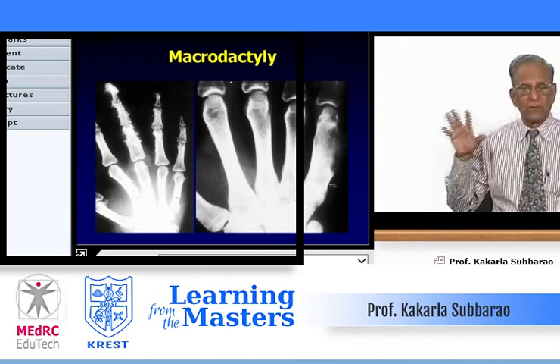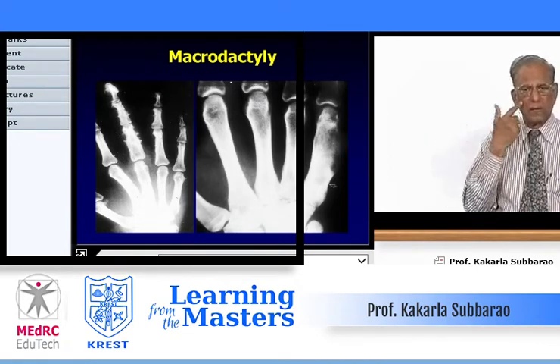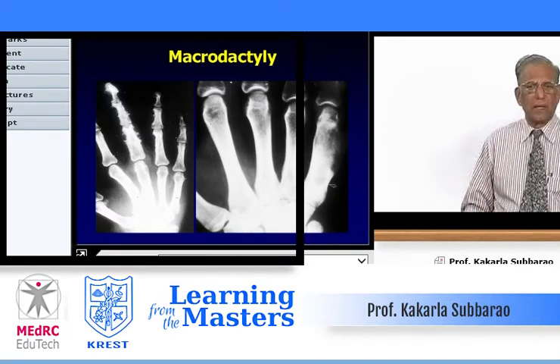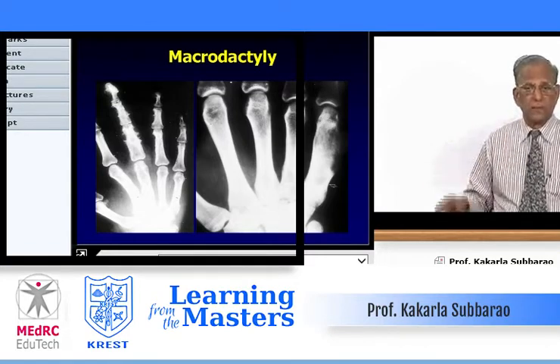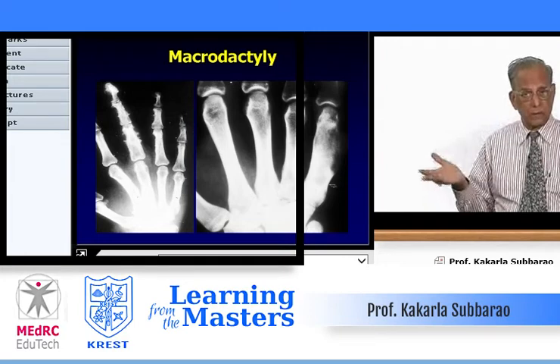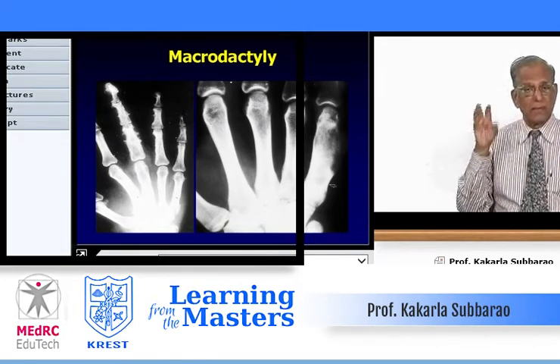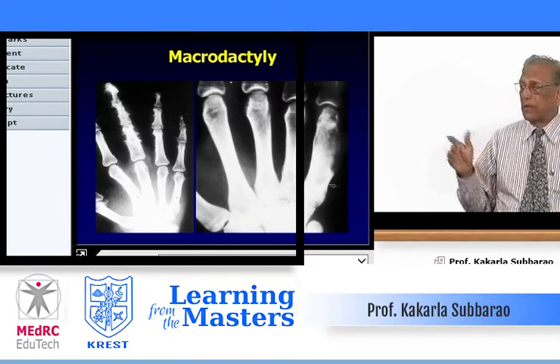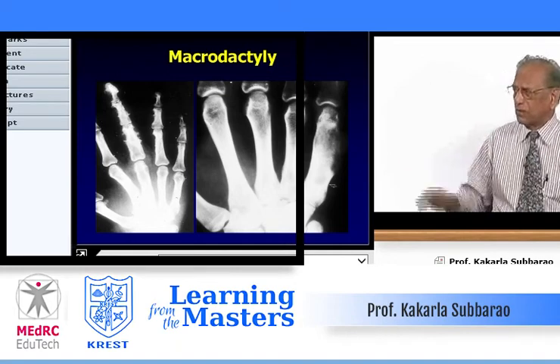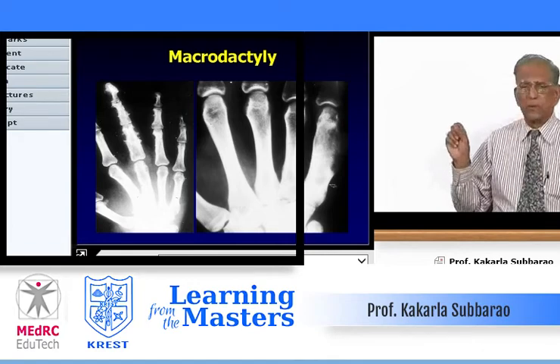Tuberous sclerosis, otherwise called epiloia, is a triad of symptoms clinically: adenoma sebaceum, and then you can get epilepsy and angiomyolipoma of the kidney, or tumors in any part of the body, including heart, brain, multiple potato-like calcific lesions, ependymal lesions.